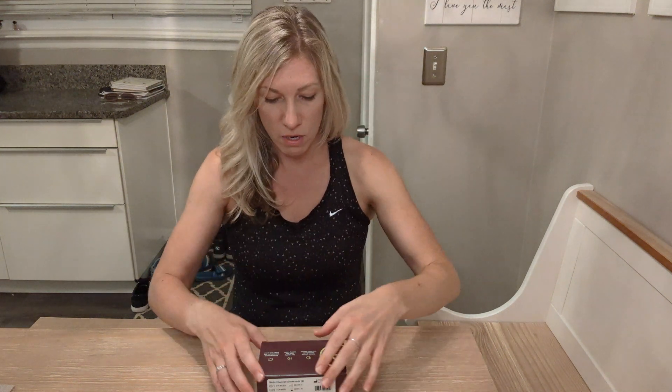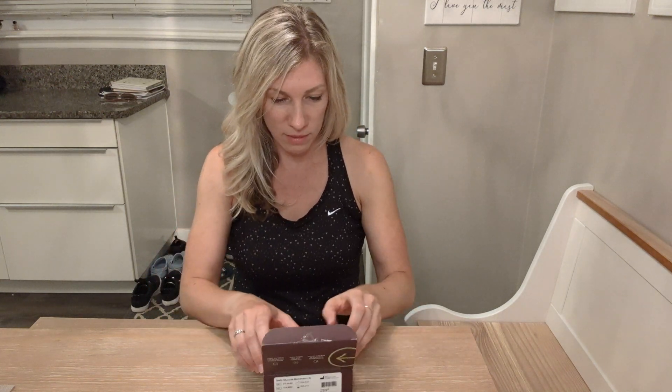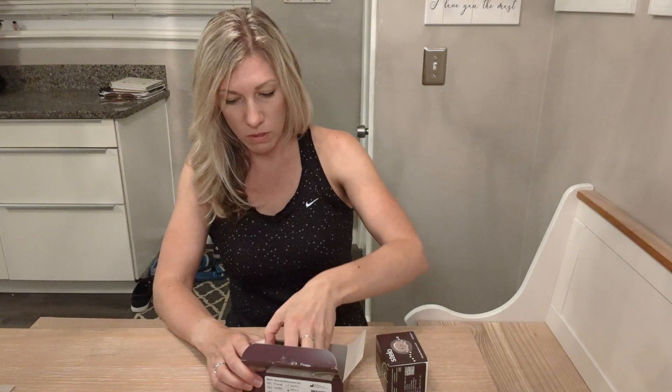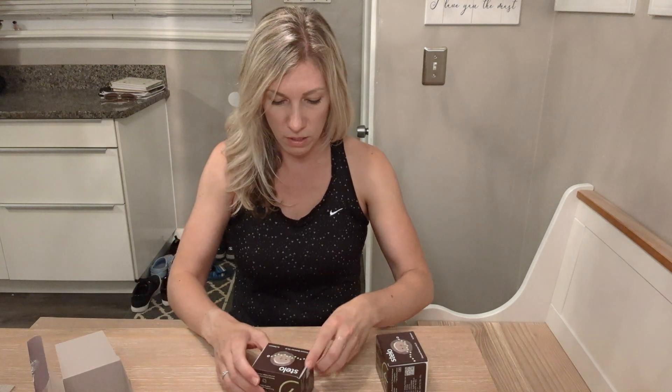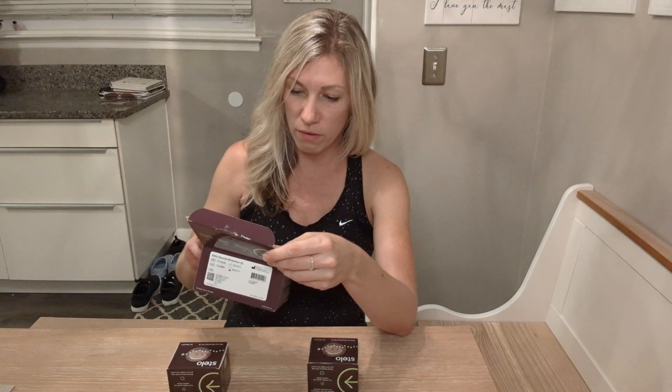I already prepped my arm — I washed the back of my arm with soap and water to get rid of any bacteria, but also to remove any lotion or oils so the adhesive sticks better. In the past, you would need a prescription from your doctor to get a continuous glucose monitor. There are two little boxes in here, and it says to download the Stelo by Dexcom app, which I've already done.